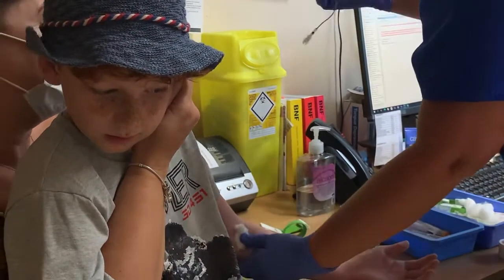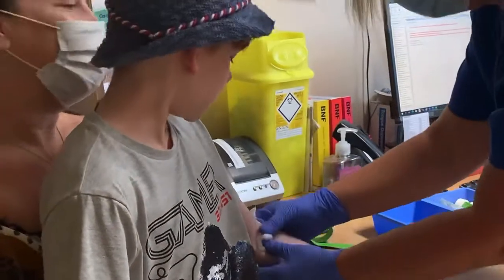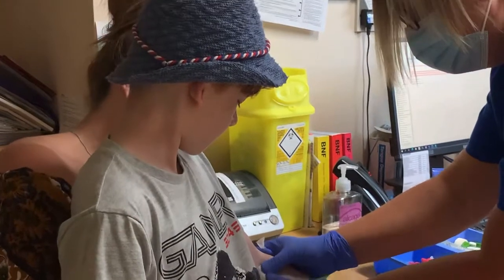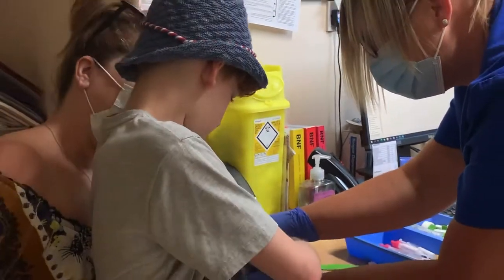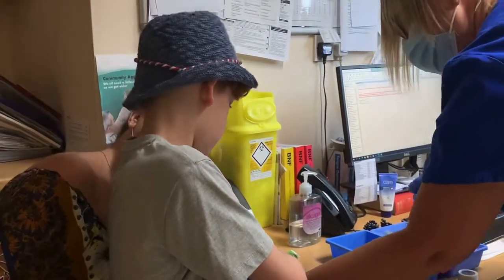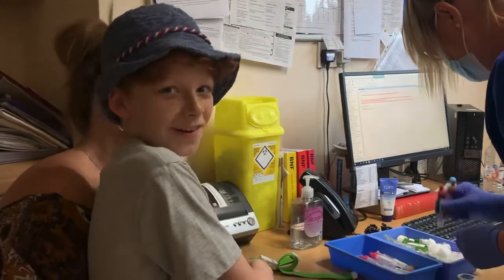Claire's got to put the needle in now — oh, like that, bish bash bosh. She's amazing! Press really hard on there for me, just press really hard to stop your bleeding. Good one, she's so good isn't she. Brave boy, well done baby.